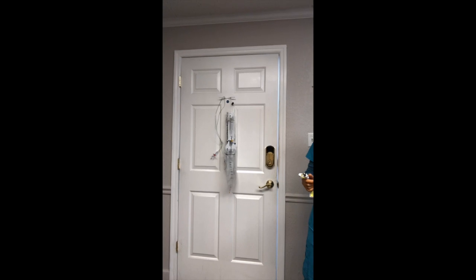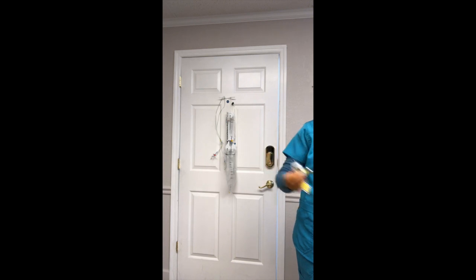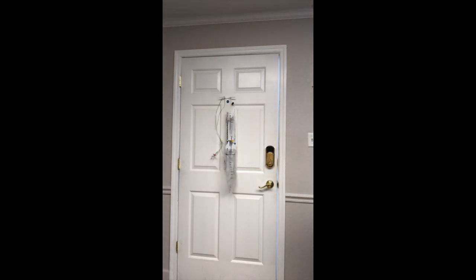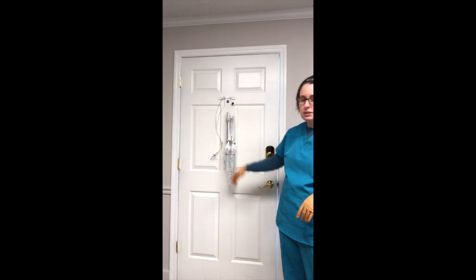For leveling the drain, it needs to be level with the tragus of the ear, or if it is a lumbar drain, the umbilicus. To zero the drain or level it, you always want to make sure you're using an approved device. Eyeballing is never accurate. You can either use a string level or a laser level. These should be stored in the supply room or come packaged in the kit. When zeroing the line, if you did have a transducer, the transducer itself would be turned off to the system to 0.